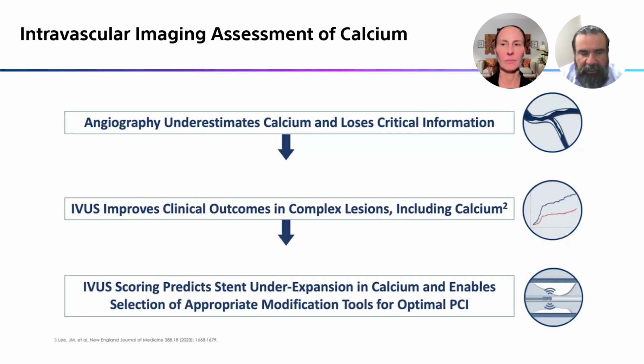And then finally, I think the scoring systems are a bit like protocols, for example the hybrid algorithms that we have. These algorithms set a framework. You go through them slowly, you learn them, and then you apply them until they become innate nature. I don't think anyone stops to actually do these scores, because ultimately the score becomes part of how you reflexively, the human brain makes habits.